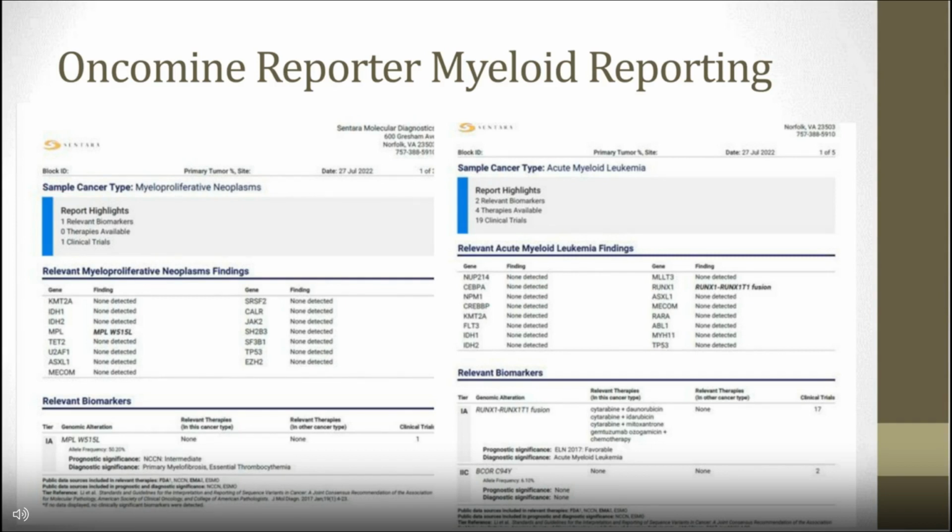The VCF file is self-contained within the platform, and we're able to get a report. So it really reduces that need to transmit these files across multiple different platforms just to get to this point where we have what we feel is a nice clean report on the back end to provide out.